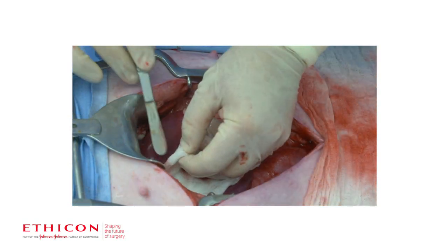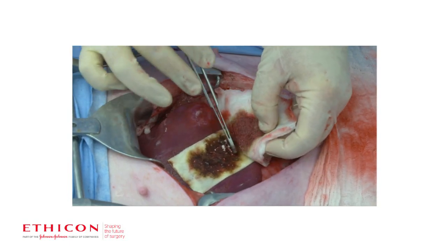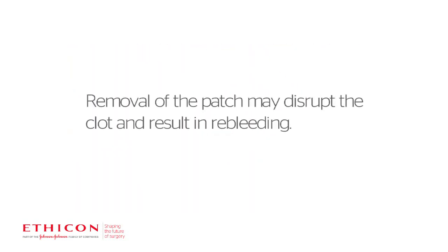Gently remove pads or gauze from the site without dislodging Everest or the clot. Inspect the patch to ensure that it is in full contact with the treated area. If placement of the patch is unsatisfactory, remove it and use a new one.